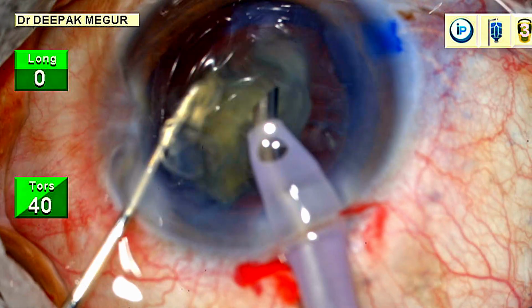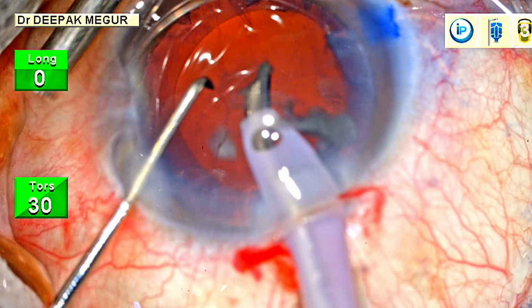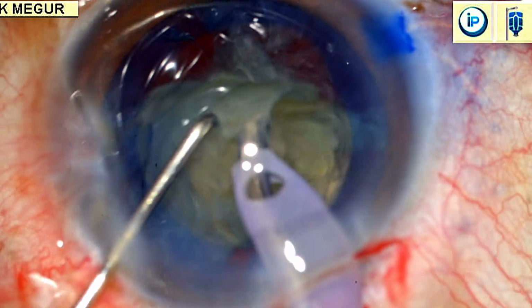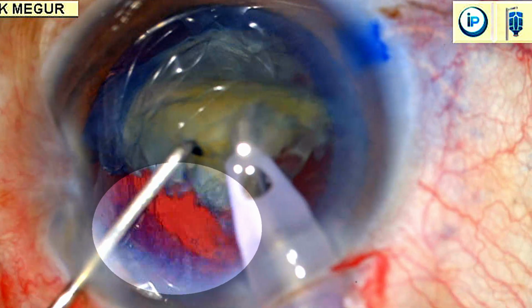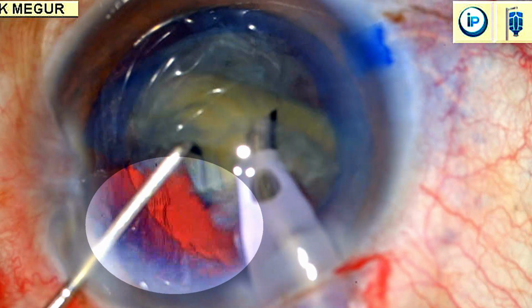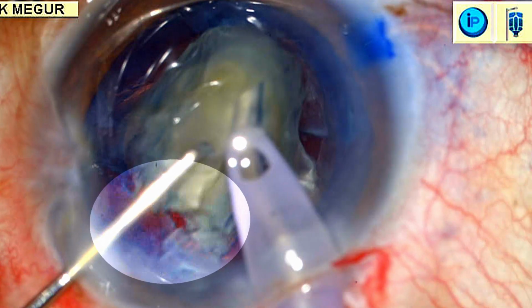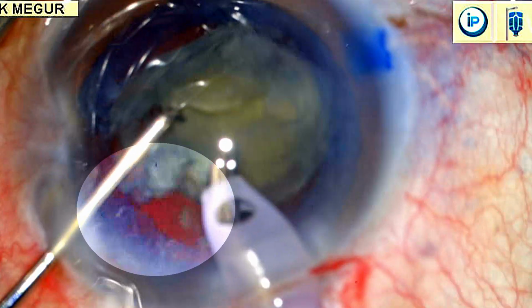The first time I noticed was actually when half of the last piece was emulsified. Actually, if I rewind, I can see at the beginning of the emulsification of the last piece itself, the enhanced red glow is visible. This part of the red glow was enhanced in the editing software, and now it is very much visible, this line, suggesting that the PC tear was already existing.